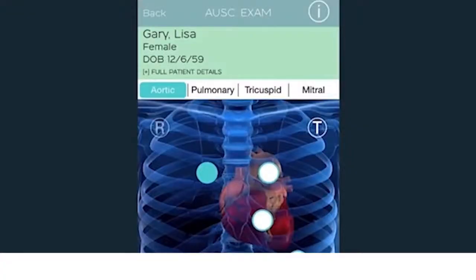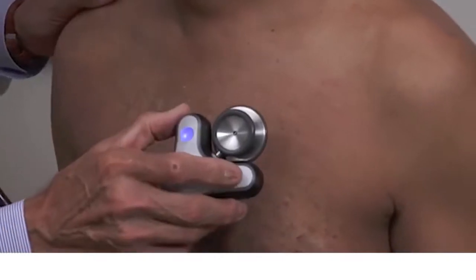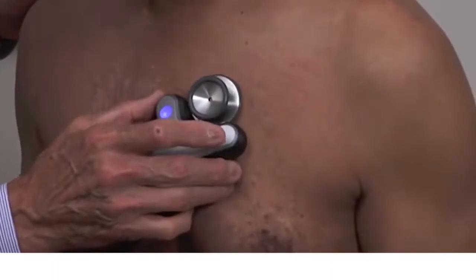Once auscultation is selected in the app, a chest illustration displays the heart valve locations for proper placement. The Cardio Sleeve is properly placed on a specific valve location.